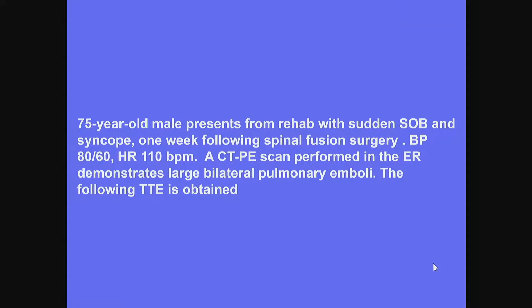This next patient is a 75-year-old male who presents from rehab with sudden shortness of breath and syncope 1 week following spinal fusion surgery. His blood pressure is 80/60, heart rate is 110 beats per minute. A CT-PE scan performed in the emergency room demonstrates large bilateral pulmonary emboli. The following transthoracic echo is obtained.